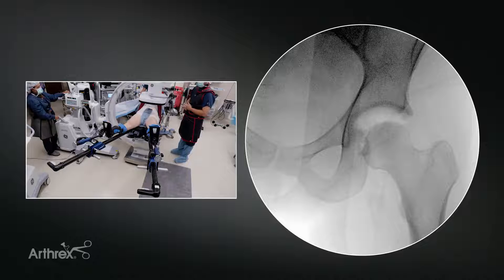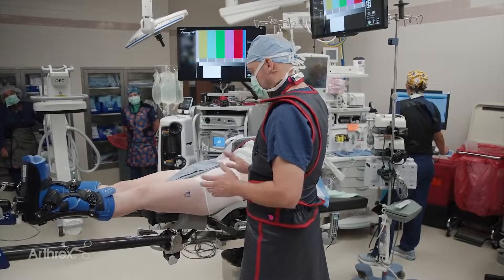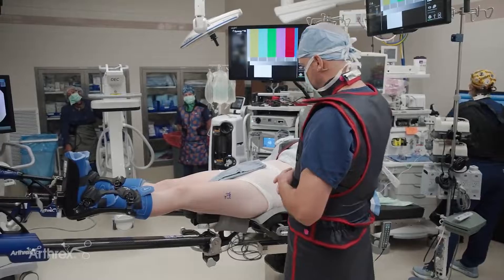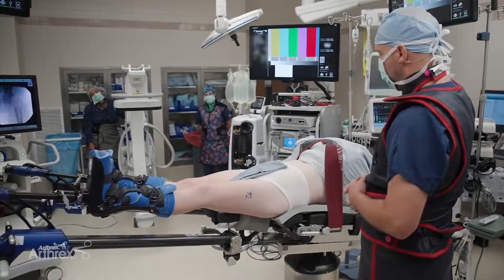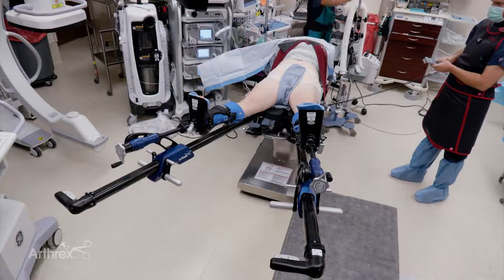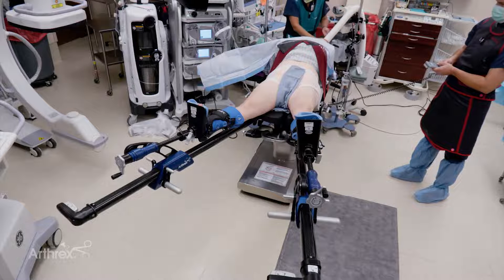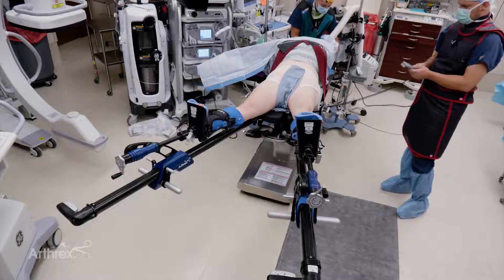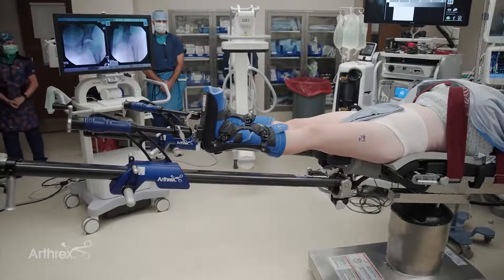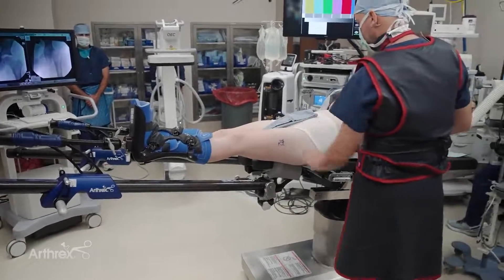Now we'll prepare for the surgical part of the case. For video purposes, the patient is wearing undergarments. They can be used, but you have to deal with them for access in the sterile field. You can also do this procedure easily without any undergarments, and you may get some more contact between the skin and the pad in that case, but both work just fine. Before we prep and drape, we'll take the patient out of a little bit of Trendelenburg. I like to keep them in some Trendelenburg, maybe 10 degrees, just for stability, which keeps the leg parallel with the floor. We'll position the bed at the appropriate height, and sometimes once the traction's applied, you need to tilt the bed — oftentimes away from the operative side to give better access to the entire soft tissue envelope.